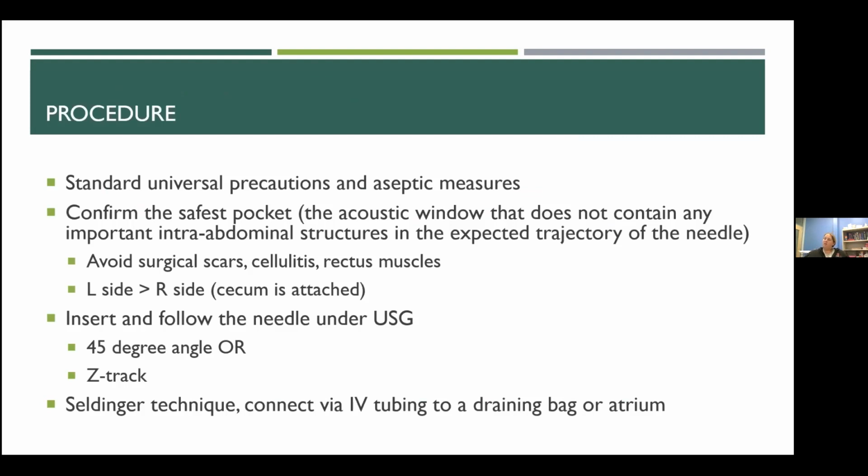I think these are all things that we've talked about. So avoiding things like surgical scars, avoiding areas of cellulitis, trying to avoid the bodies of your recti. If your fluid is globally distributed, try to go on the left side more than the right side, because the cecum is more adherent and a little bit more attached. So that means the intestine on that side is a little less free flowing.